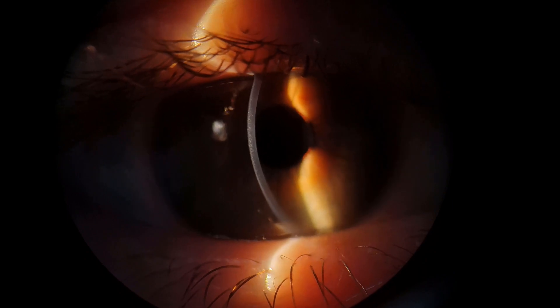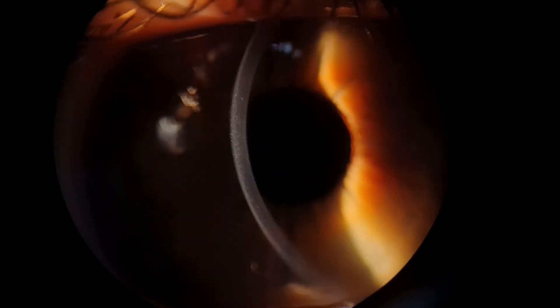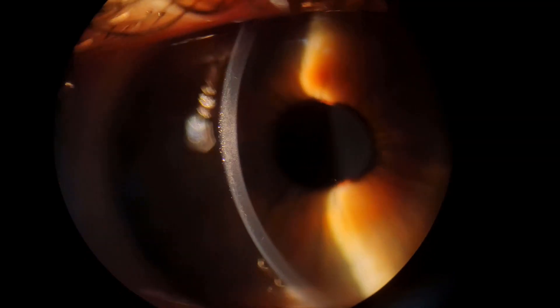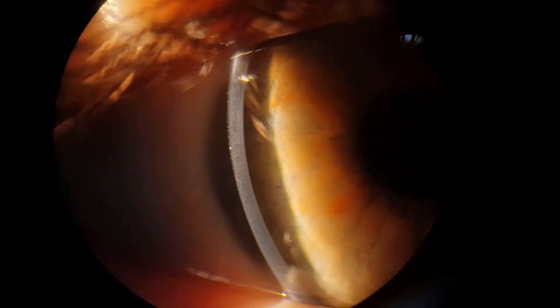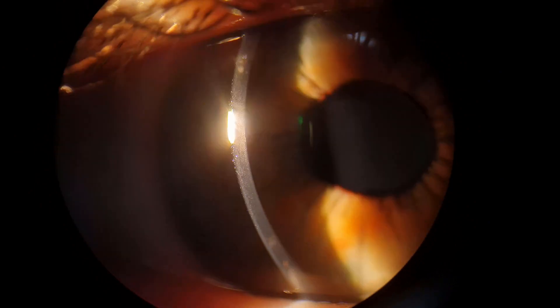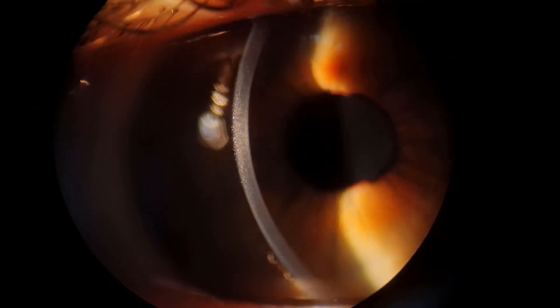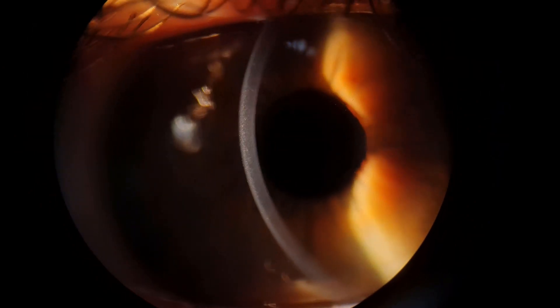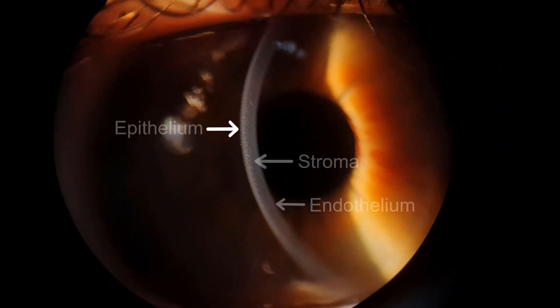As you can see, it optically dissects the cornea and you can see a cross section. You can use increased magnifications to help you find specific structures such as the epithelium, stroma, or endothelium.